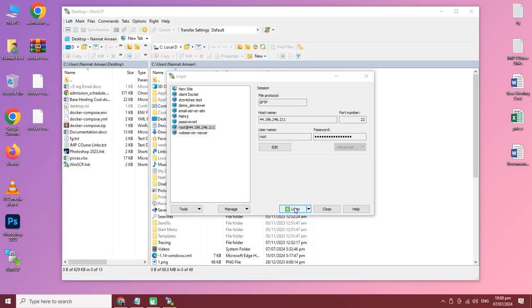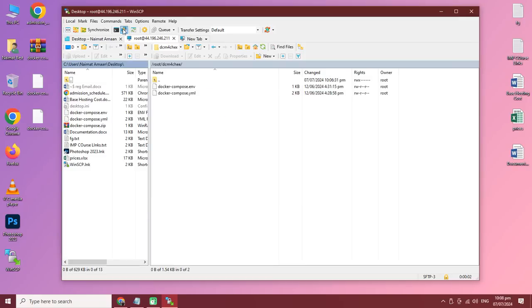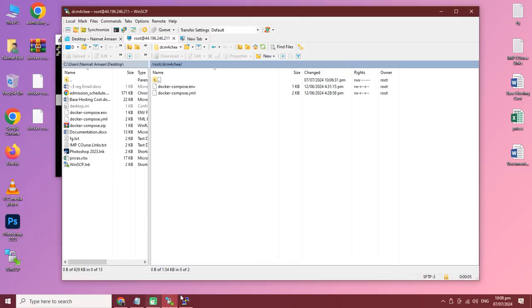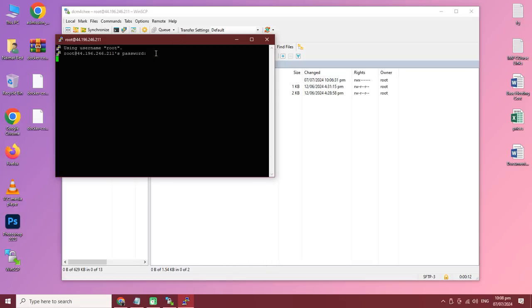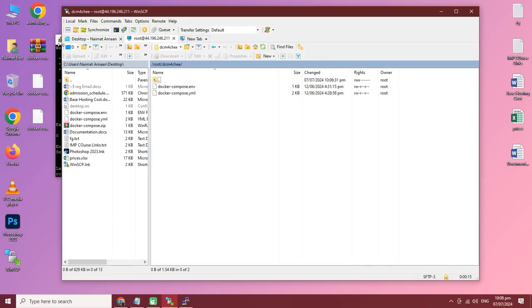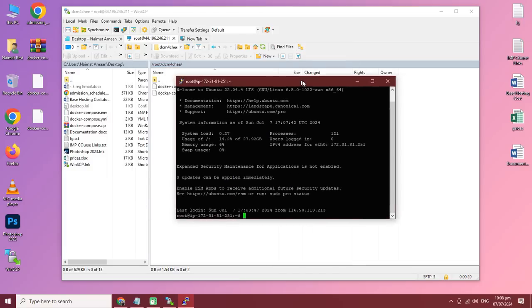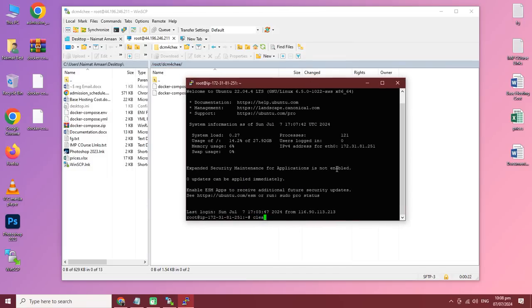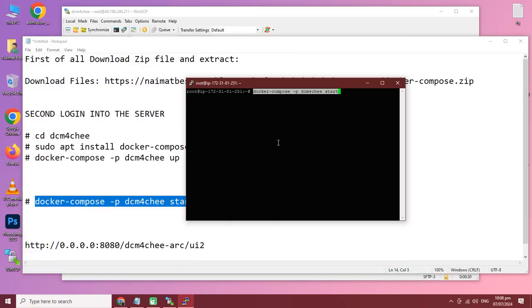We have rebooted our server. Now we need to log in again. Connect PuTTY again, then clear the terminal and start DCM4CHEE with this command.